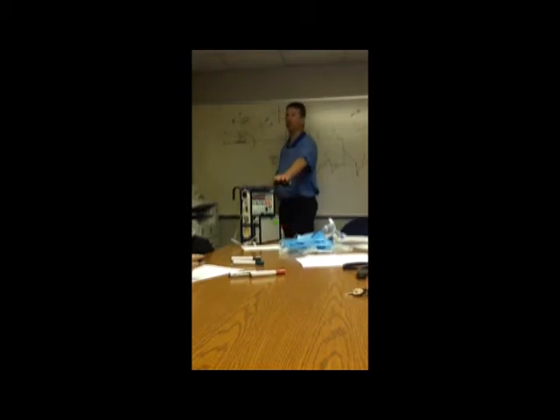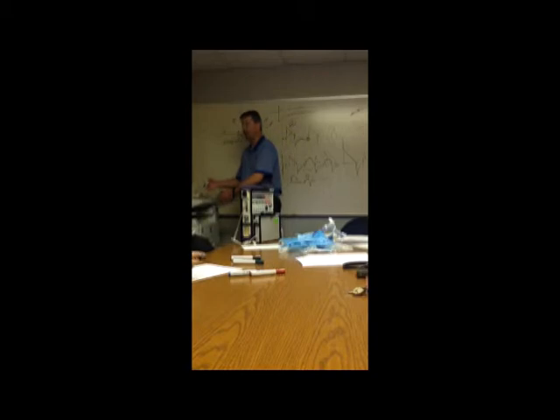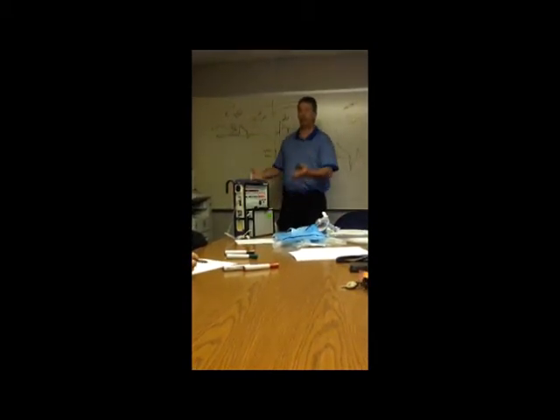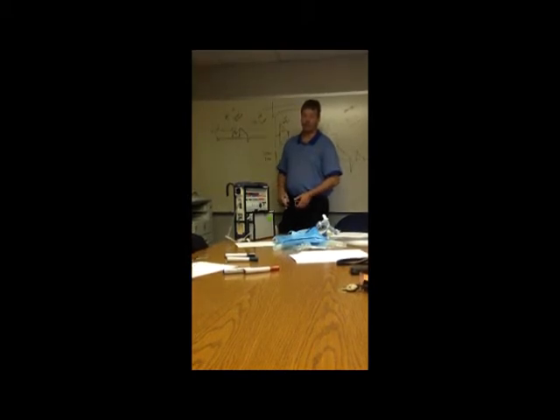So if you're adjusting your EPAP, you don't need to worry about changing your IPAP. It's going to stay the same. That's one good thing about this. But if you're at a BiPAP machine, if I go up on the EPAP, I took that out of my IPAP, they're going to have less tidal volumes. I need to adjust. So for that case, it's better. But if 100 ain't doing it, start going up on the EPAP.